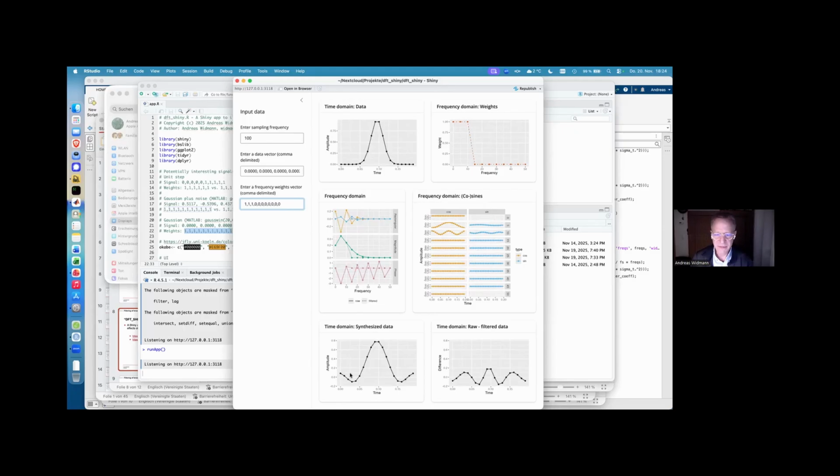This is the very prototypical low-pass distortion of monopolar signals, which is what ERPs and ERFs typically are. So ERPs are not oscillations, but monopolar signals looking a bit like a Gaussian, even if that might just be random.